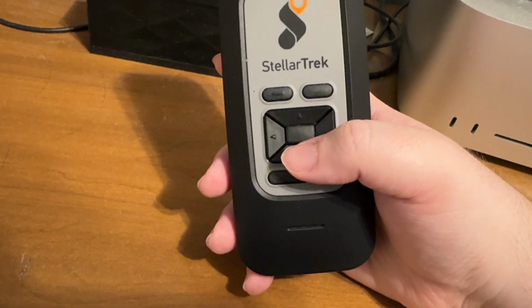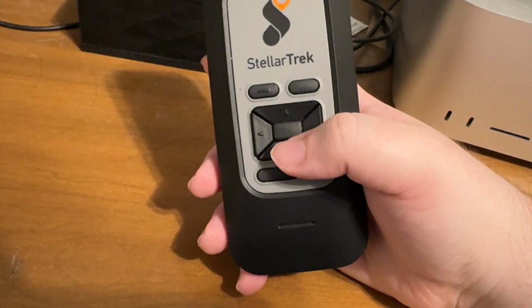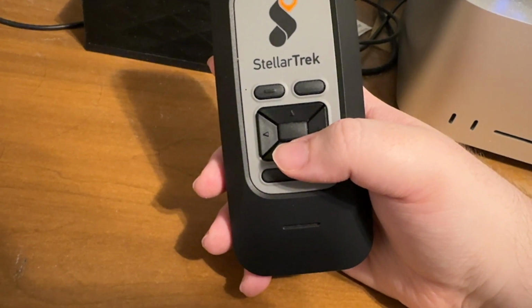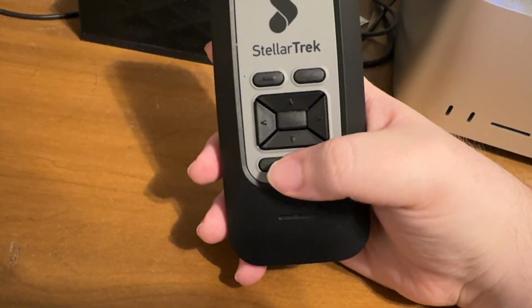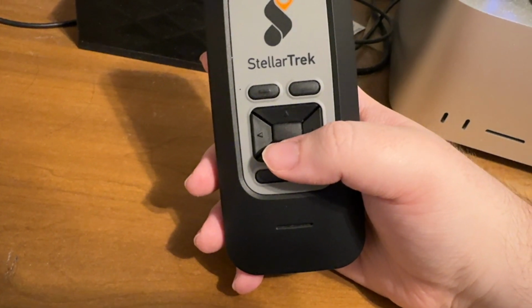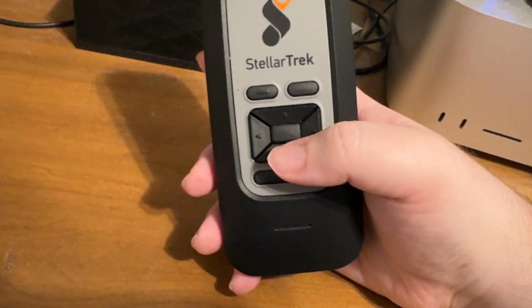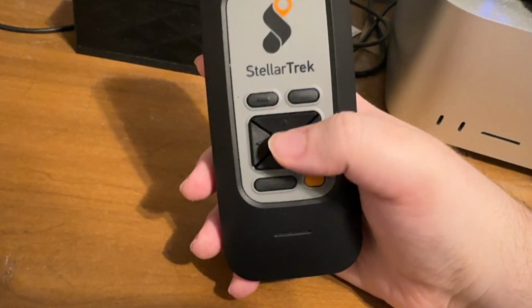We could enter map browsing mode. Press confirm to enter map browsing mode from this location, which would allow us to browse the map as if we were at this location, which happens to be a Dunkin' Donuts. Delete landmark. We could delete the landmark. Rename landmark with audio. Rename the selected landmark. And now we have two options. We do have two options for renaming. We can rename with audio or with text. I'll demonstrate both of these.